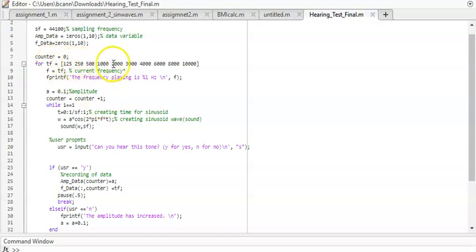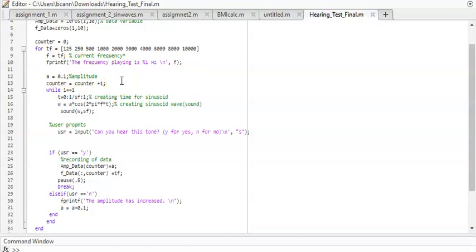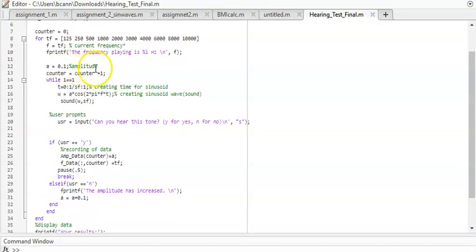So this is all the frequencies we'll be testing on the user. And then this is to have an input for which frequency will be used. Well, we will have a user prompt about what frequency is currently playing visually. When the code starts, the amplitude will start at 0.1 and will increase in increments of 0.1 if the user inputs a no, as an N.